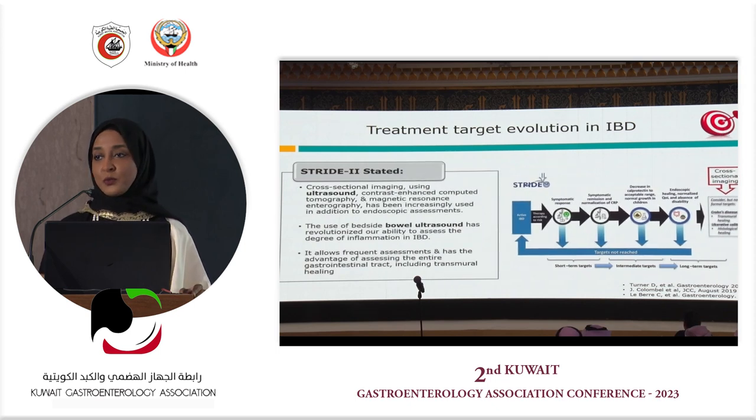As a doctor who knows how to do bowel ultrasound, I'm very happy that STRIDE-2 has included bowel ultrasound as one of the imaging modalities that can be used to monitor and diagnose an IBD patient. Also, they stated that bowel ultrasound has a good ability to assess the degree of inflammation. It also has the advantage of visualizing the whole GI tract, including transmural healing, which is the target of most IBD specialists.